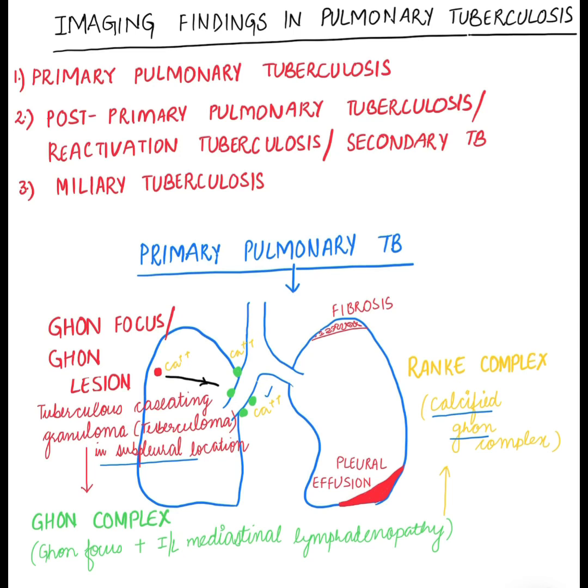Good evening, everyone. Today's topic is imaging findings in pulmonary tuberculosis.